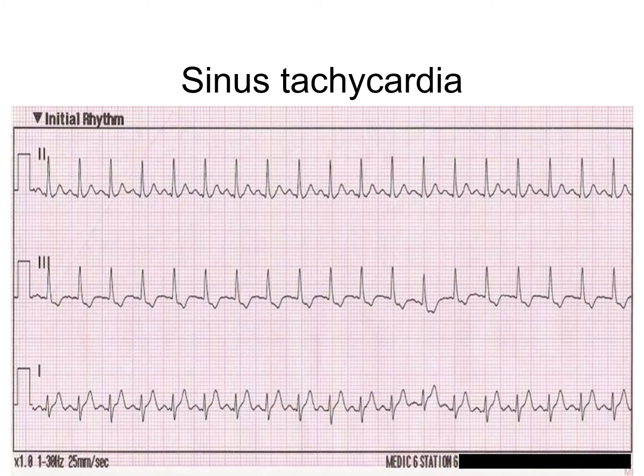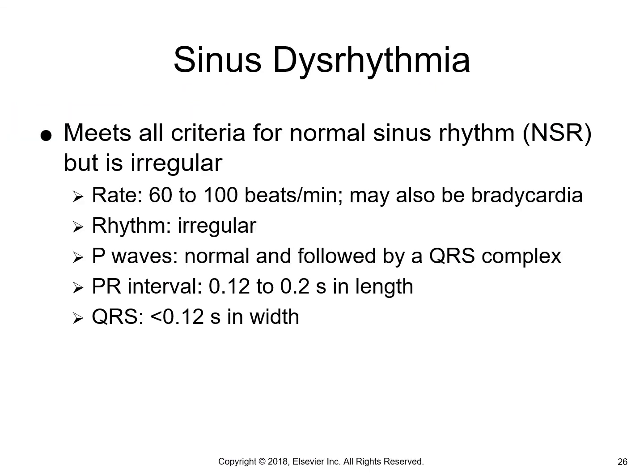Okay, so here is another view of sinus tach, just another example. All right, moving on to sinus dysrhythmias.